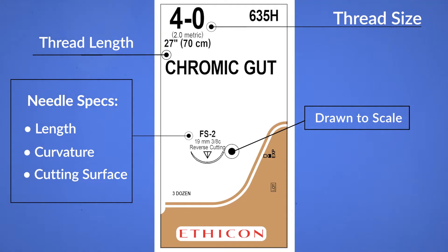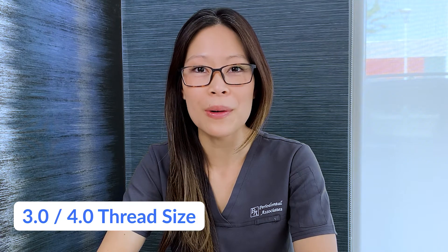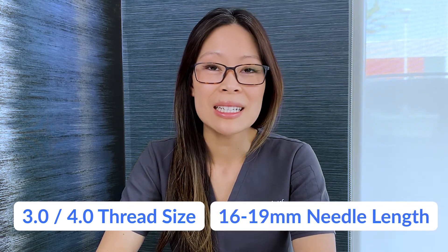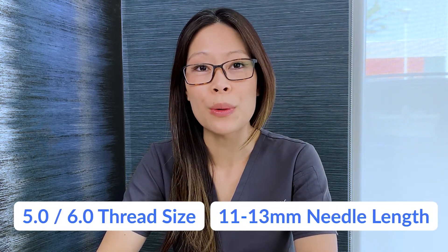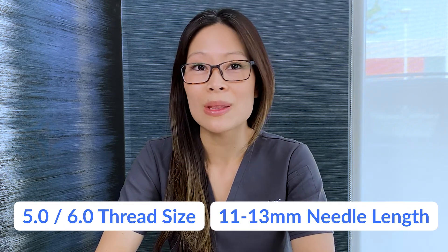You'll know exactly what needle size is inside without opening it first. I would recommend keeping things simple when possible. For example, all the suture needles in our office are 3/8 curvature and are all reverse cutting. For larger thread sizes such as 3.0 and 4.0, the needle lengths are anywhere between 16 to 19 millimeters, and for the smaller thread sizes 5.0 or 6.0, the needle lengths are between 11 to 13 millimeters.